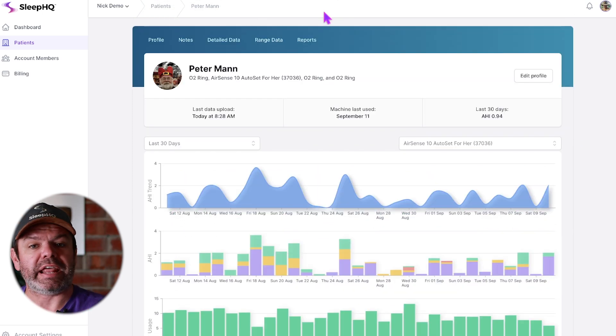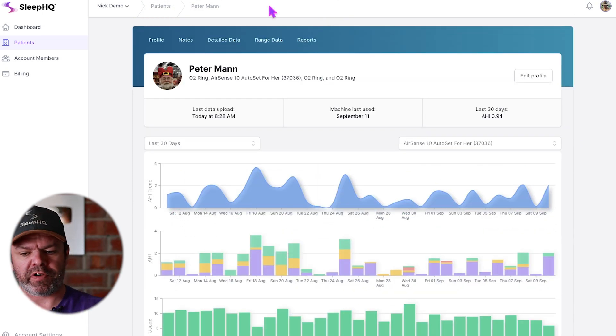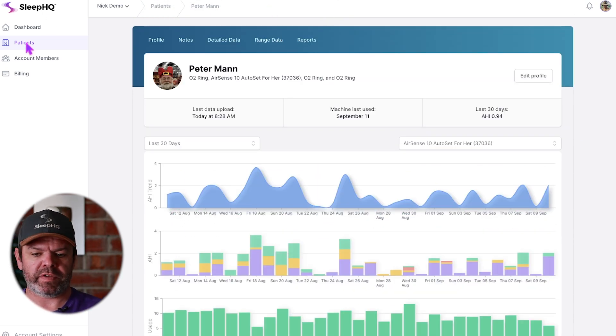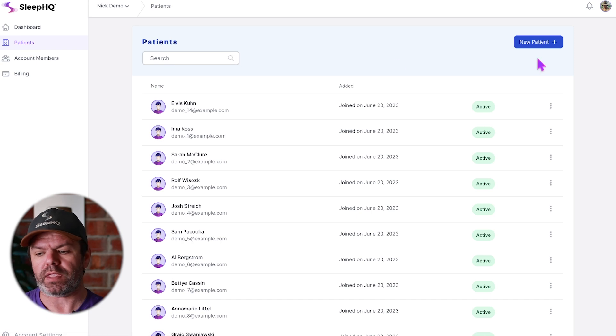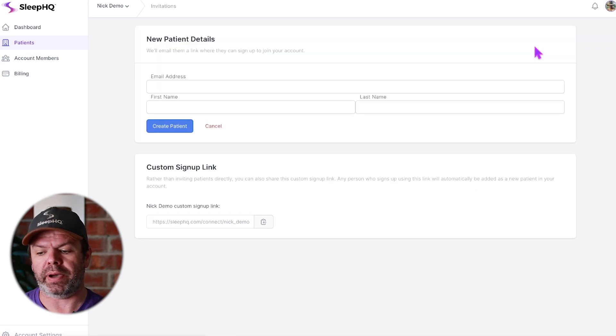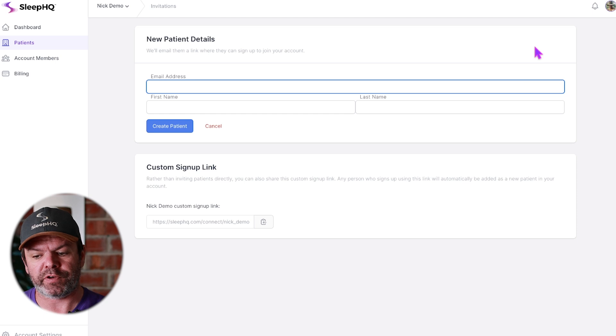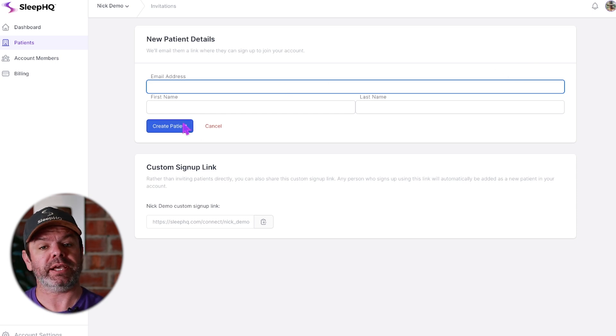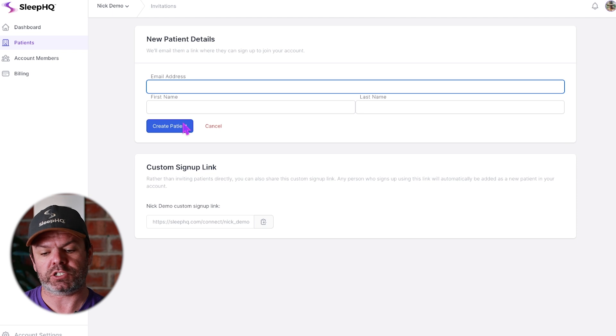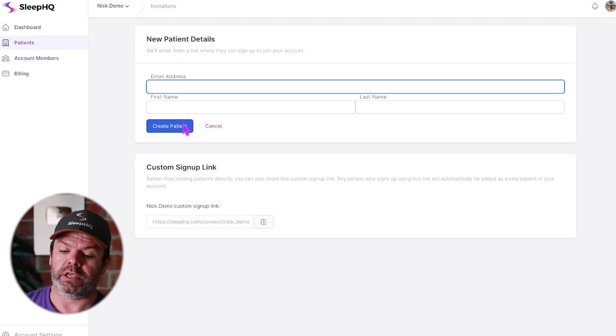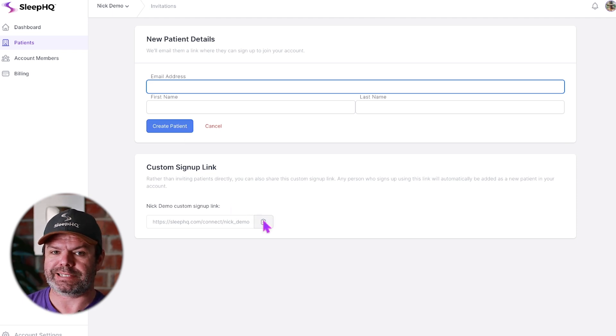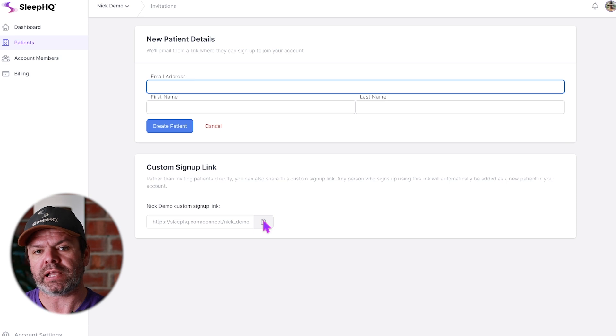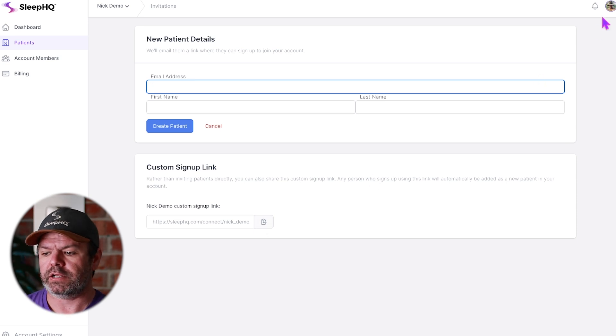Now if you want to add a new patient, it's very easy. Come over here to the patients tab and click New Patient. Type in their email address, first name, and last name, and click Create Patient. This will send them an email to sign up to Sleep HQ, or you can just copy this link down here and send that link. When they click that link, I'll show you what it looks like.